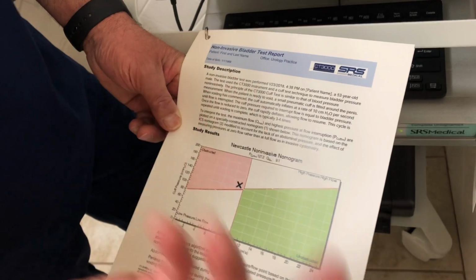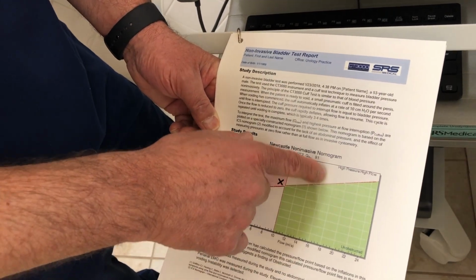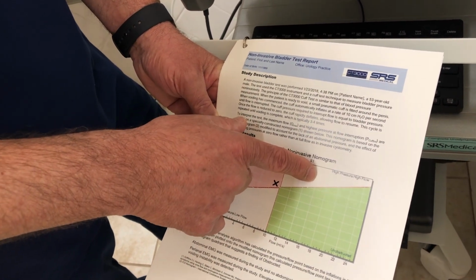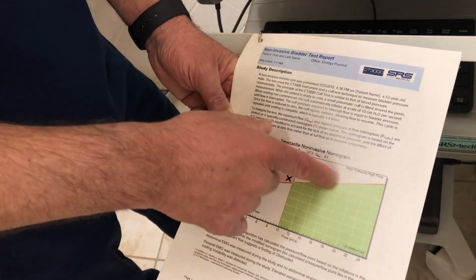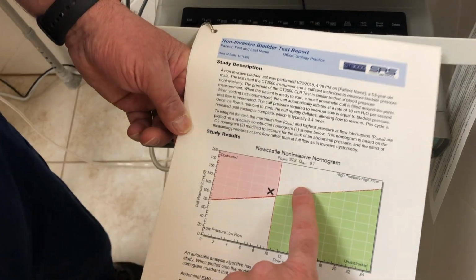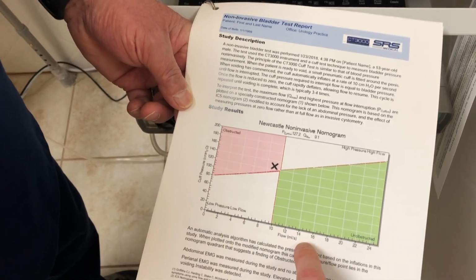So you gauge that with a follow-up. Maybe it's a 6-month follow-up, and what you're finding is the patient has now moved into a higher bladder pressure, relatively the same flow, symptoms are relatively the same, but now his bladder pressure has increased, compensating to performing at maximum pressure. So in this quadrant, the bladder pressure has gone up to compensate for the obstruction, and that's why the flow is still good.